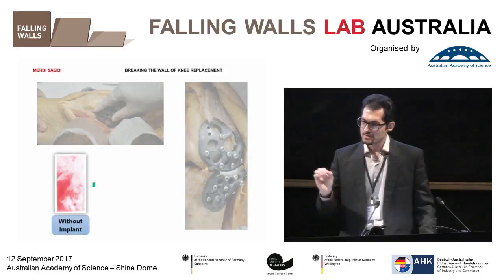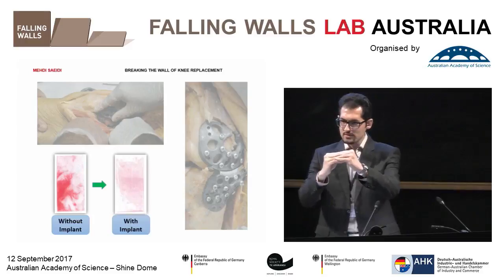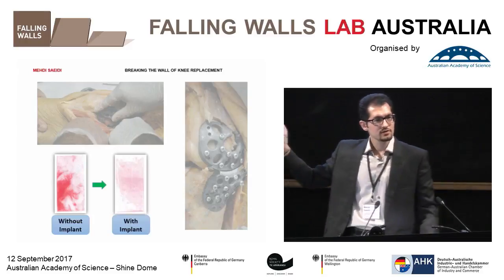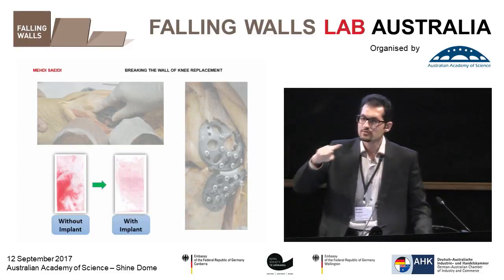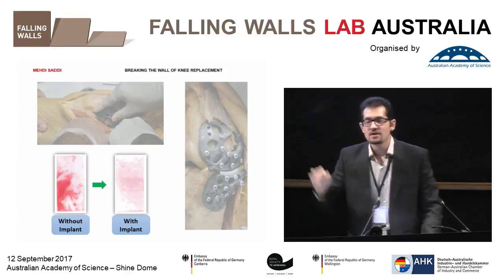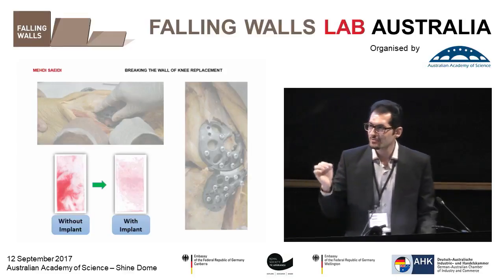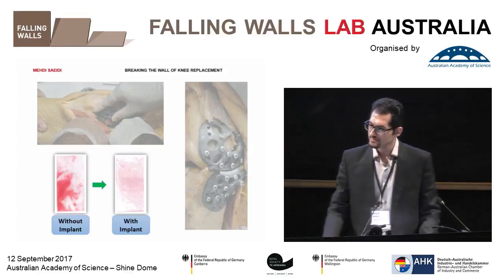These pressure film sensors were inserted between the femur and tibia on the medial side with and without using the implant. The lighter color for the experiment with implant shows that part of the knee load is transferred through the implant instead of the knee. This load reduction means that osteoarthritis will slow down and cartilage will repair when the implant is used.